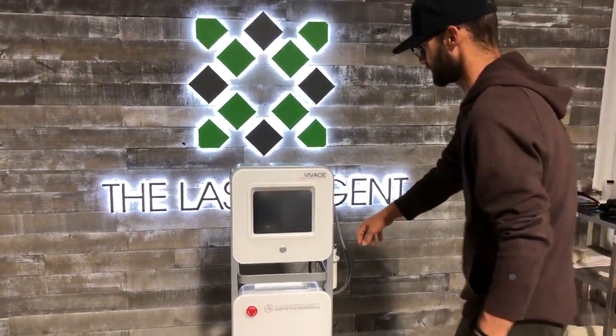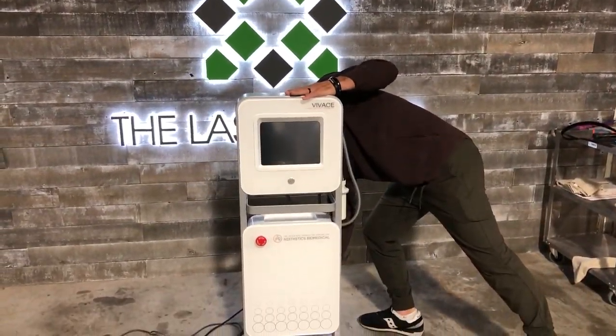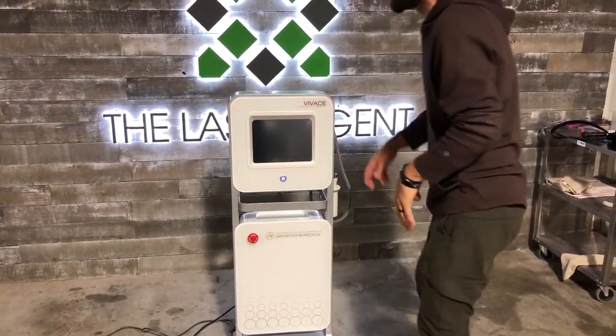All right, Dr. Seiler, here's your Vivace. It's simple — you just flip the switch in the back, the blue button comes on, turn it on. It only takes maybe 30 seconds and it's already ready.